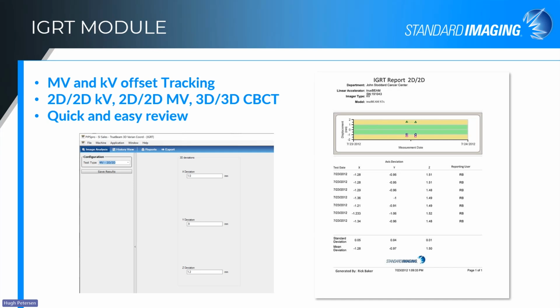We also have our IsoCube Phantom, which is similar in scope, but there are other phantoms out there for this type of test, such as maybe the PentaGuide, that can be utilized as well. So again, we try to be vendor neutral and agnostic. You don't have to specifically use all our phantoms for some of the capabilities, but we'd prefer if you would. But we understand that there are other phantoms out there. But that's the IGRT module.